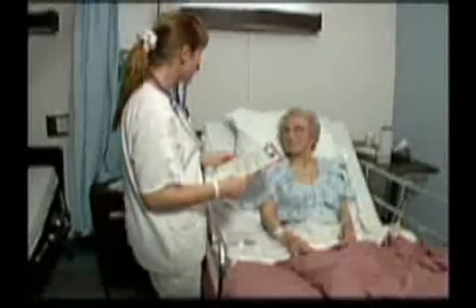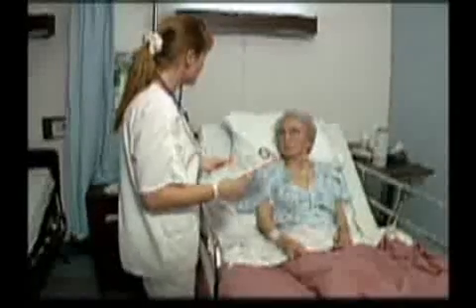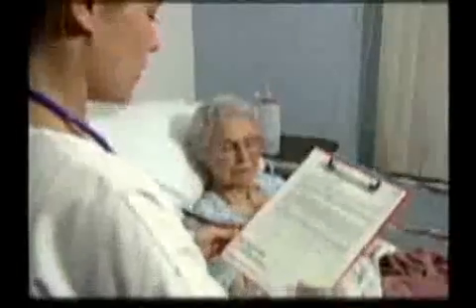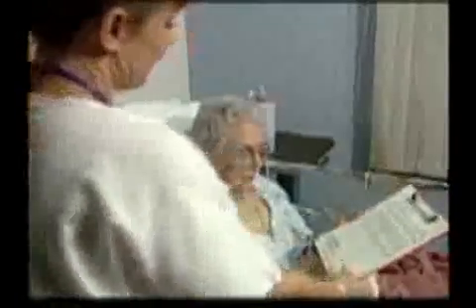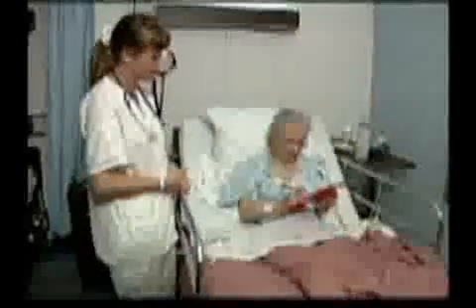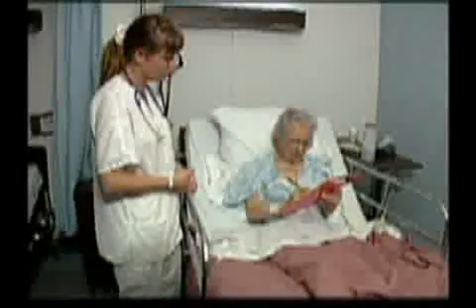The first step in preparing a patient for an angiogram is to review the procedure with the patient and obtain a signed consent for treatment. Any tests that have been ordered should also be reviewed, and the cardiologist notified of any abnormal results.